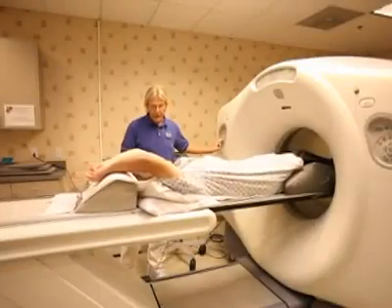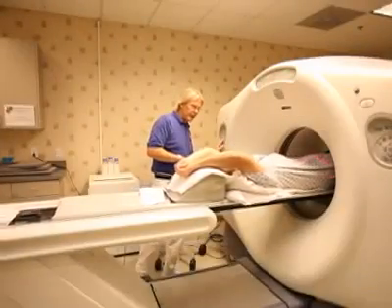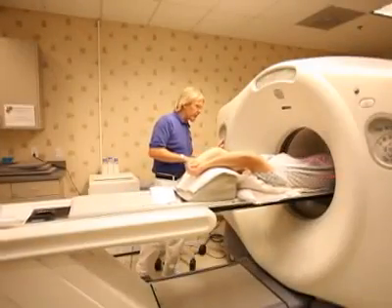After all the electrodes are on and tested, we then move you into the scanner.